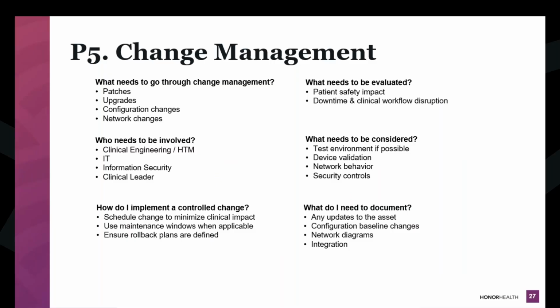So really HTM should be involved in any change. IT, information security, a clinical leader, all those people need to be notified if we're making a change to a system that's significant. And evaluate it, right? Patient safety impact, what does that impact if we're making that change? What is the impact if it goes sideways? And what does that downtime look like? How fast can we get it back up?